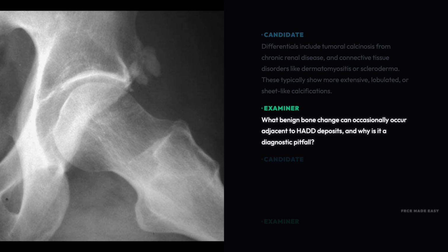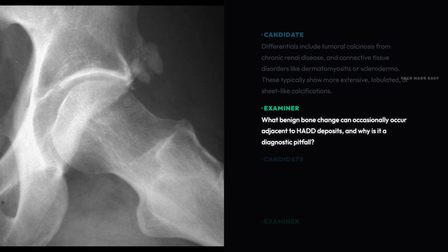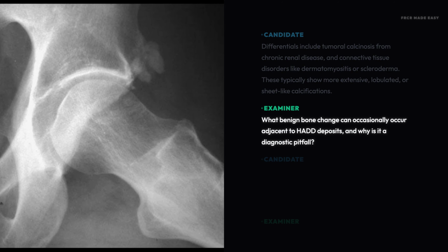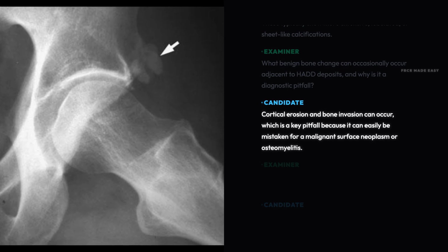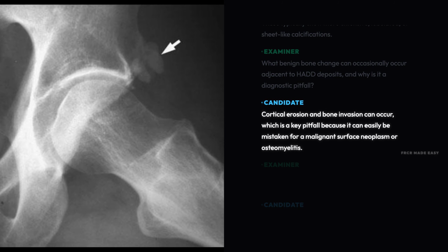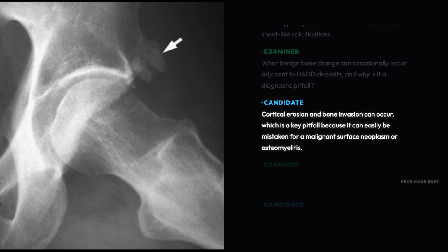What benign bone change can occasionally occur adjacent to HADD deposits, and why is it a diagnostic pitfall? Cortical erosion and bone invasion can occur, which is a key pitfall because it can easily be mistaken for a malignant surface neoplasm or osteomyelitis.